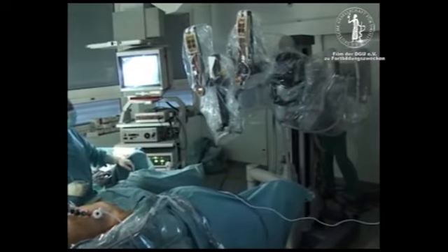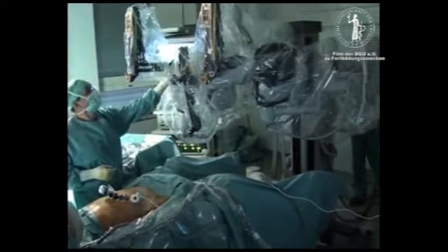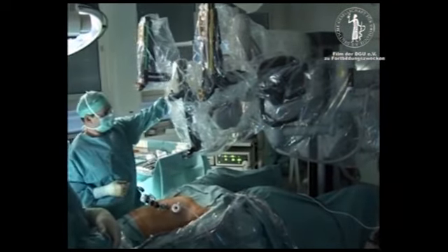At this point, the patient is placed in a moderate Trendelenburg position and the table is lowered as far as possible. The robotic cart is driven in between the patient's abducted and slightly lowered legs. Care must be taken that the arms do not become unsterile, for example on the OR light, which must be moved out of the way.